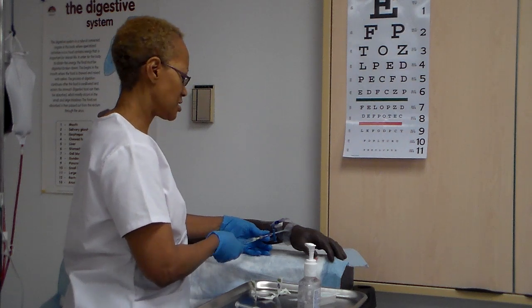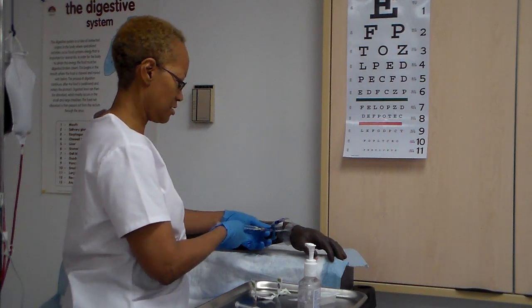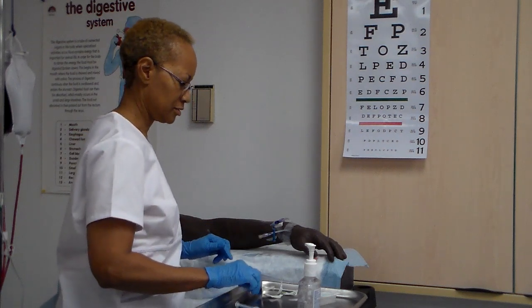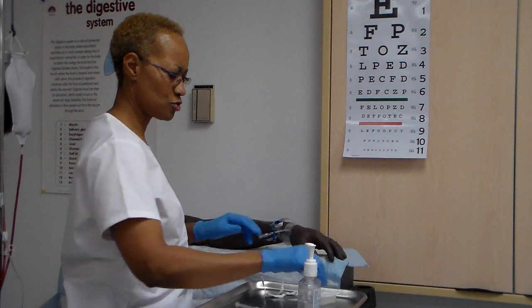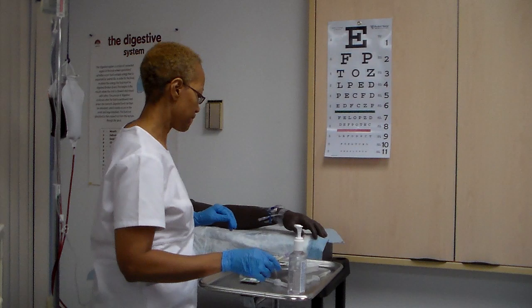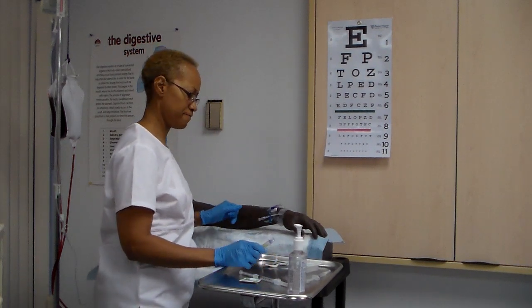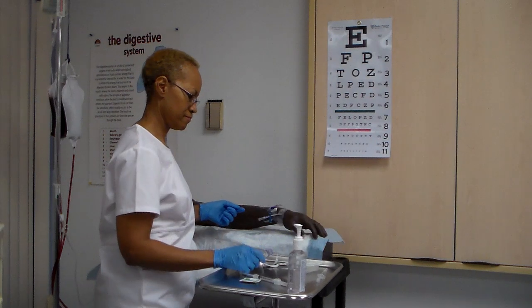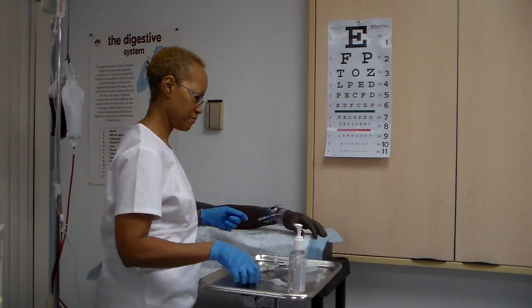You're going to find that the mannequins aren't going to flush very well, so okay. Great. Okay, tap it using the scoop method. Pull back gently on syringe plunger and look for blood return. Did that. Flush IV lock with normal saline by pushing slowly on plunger. Did that. Remove saline-filled syringe. Clean lock injection port with antiseptic swab.